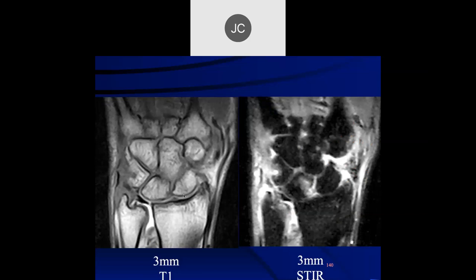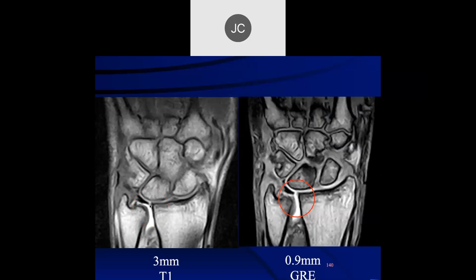Robert: on the 3mm T1s it looks like there may be another central perforation, but there is a DRUJ effusion. It must be an arthrogram because we see bright fluid here — it looks like it's going through. It could be a defect at the radial insertion of the TFC. If we go to the thinner cuts, on this low-field scanner, we can actually see the details of the perforation better — this is really an insertional tear of the TFC on the radius.